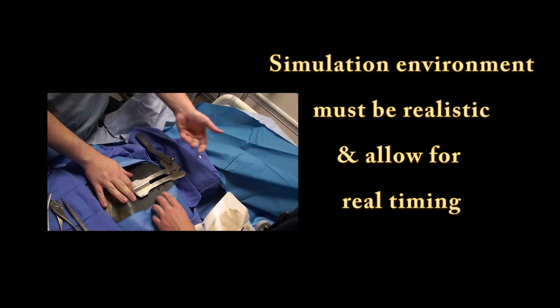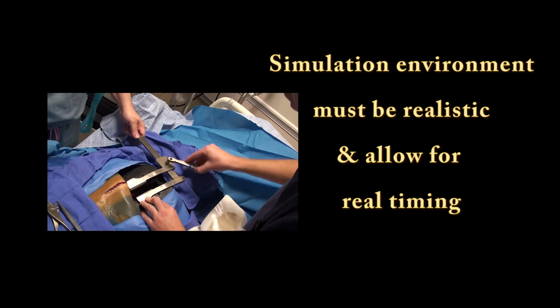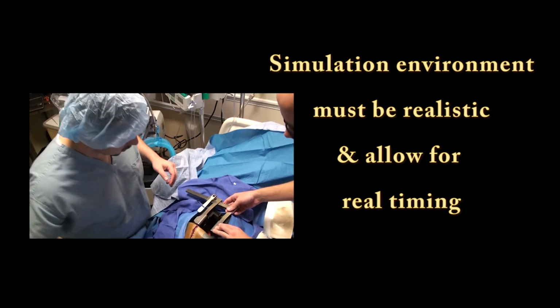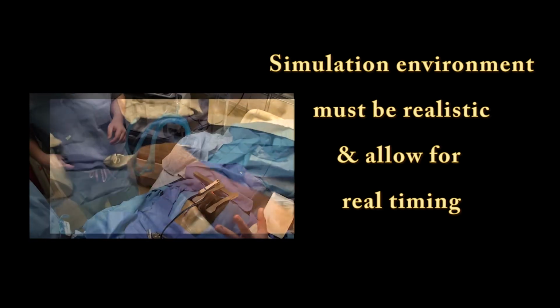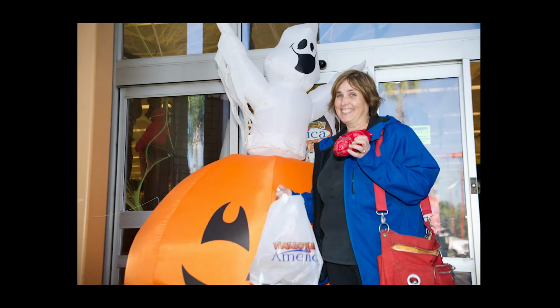The audit tool will only be useful if your simulation allows the team to perform all of the steps in the procedure outlined in the tool in real time. However, many low-volume, low-resource ICUs don't have the funds to purchase commercially available realistic simulation equipment. By being creative, we're able to develop a reusable, realistic simulation patient for under $50 by finding an old CPR mannequin and purchasing a few items from the Halloween store.